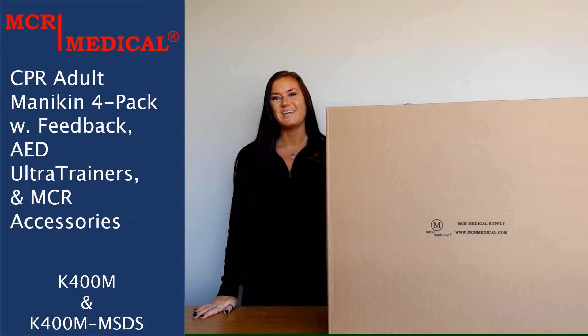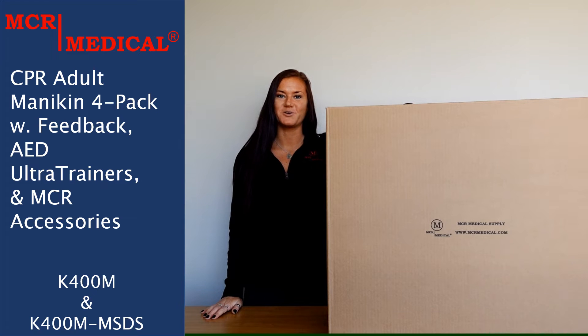Hello everyone, my name is Mackenzie and I work here at MCR Medical. Today I'm going to be unboxing the K400M CPR training kit.